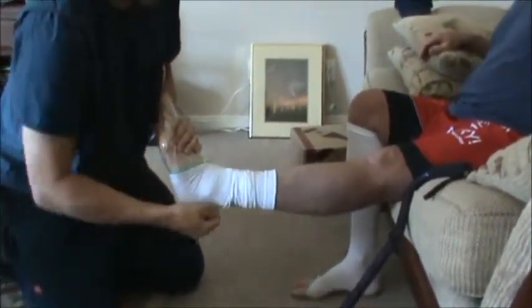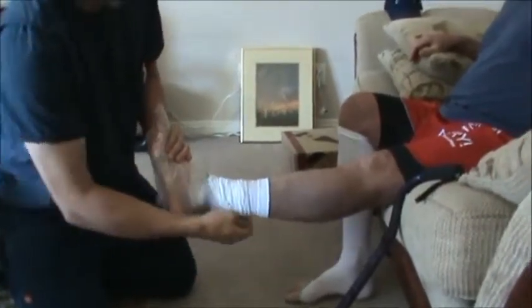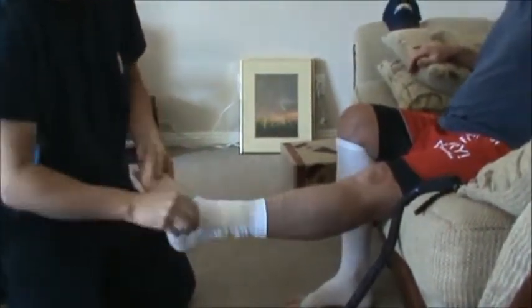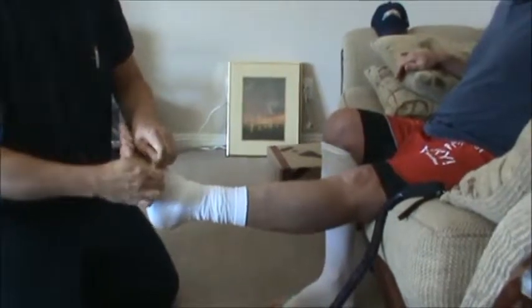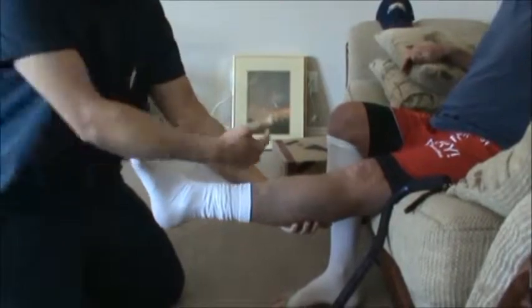I'm going to be showing the nurses how to do this — this is going to be on widescreen TV. Remove the bag. Part of it is having strong fingers and muscles. Would you put this on the same way for knee surgery? Yes, just support that leg.